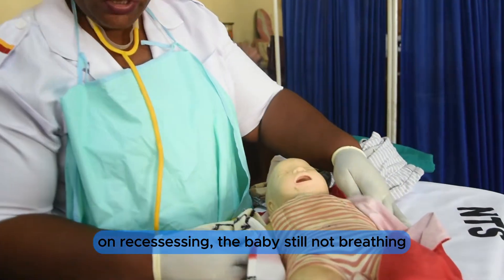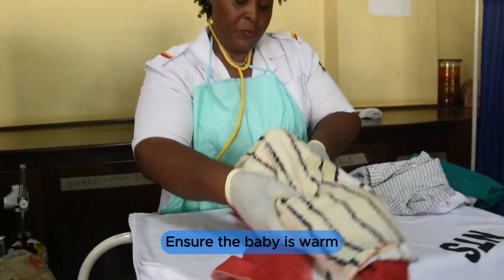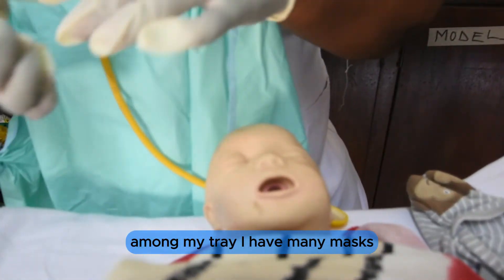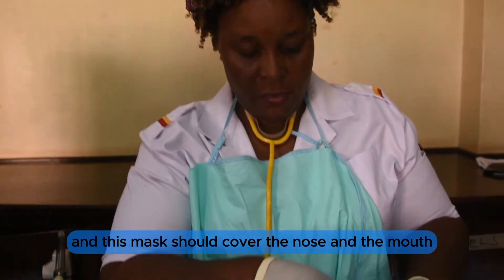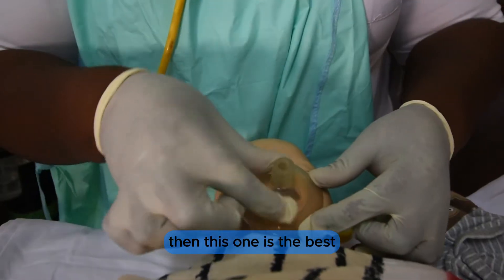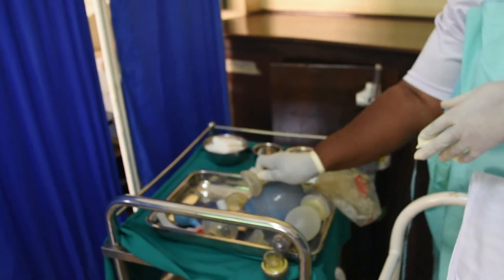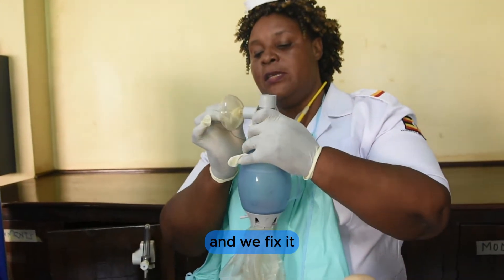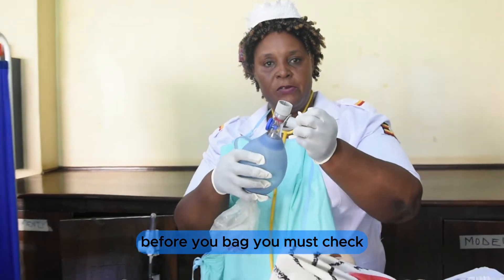On reassessing, the baby is still not breathing. Ensure the baby is warm and turn the neck towards you. Among my tray I have many masks — check for a fitting mask that covers the nose and the mouth. I select the best-fitting one, fix the Ambu bag to the mask, and check before you bag — you must check.